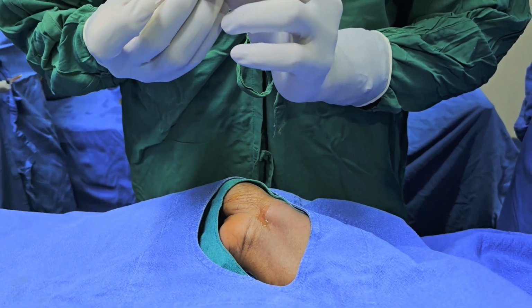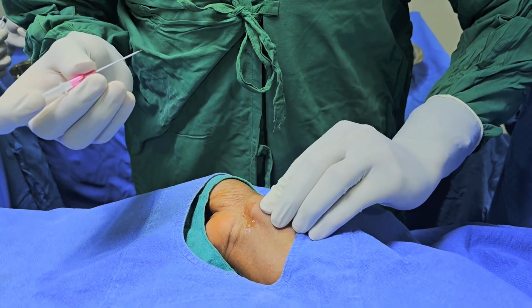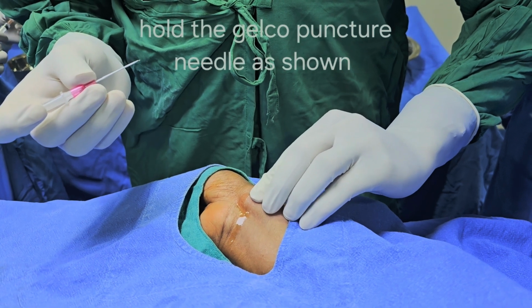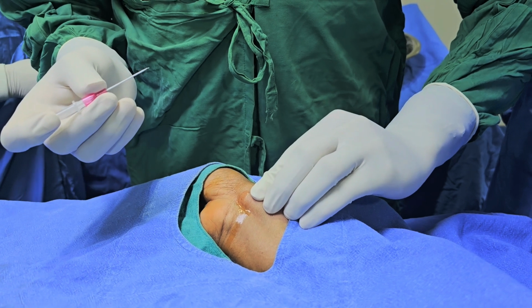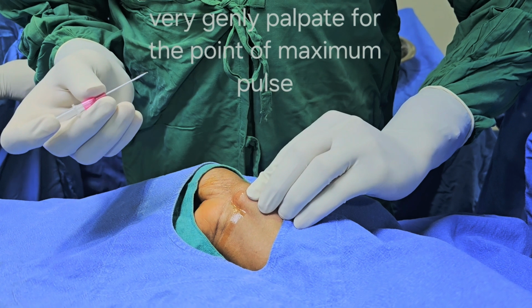There is another metallic needle by Cook. This needle does not have an inner stylet. This can be used for sclerotic radial arteries. The advantage is that it minimizes the number of steps. The disadvantage is that if you miss the puncture, there is a possibility of the radial artery going into spasm.